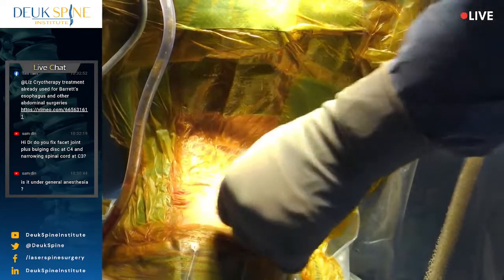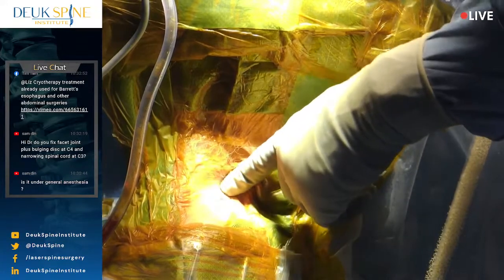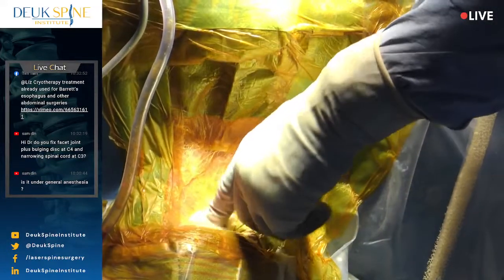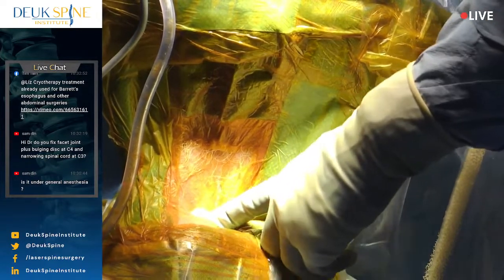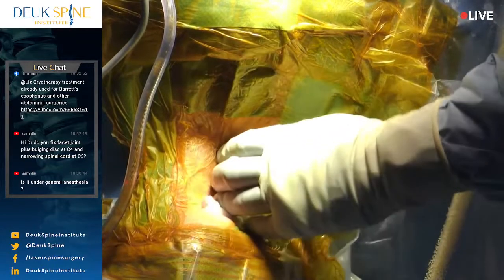Anyway, that should be good on the pressure. Again, we're not cutting any blood vessels, arteries, or anything. It's just a little oozing from under the skin. I think because he's had now 3.5 drops of blood, he must have been taking something herbal that's causing him to ooze a little bit, inhibiting platelet function. But long story short, it's nothing.